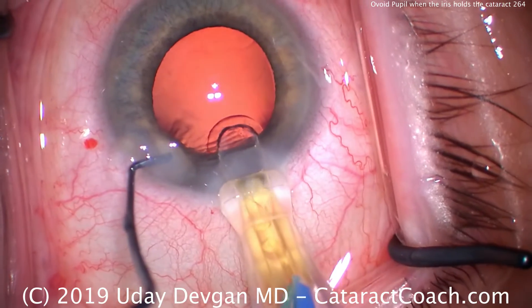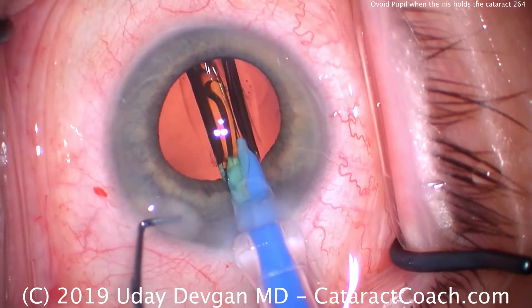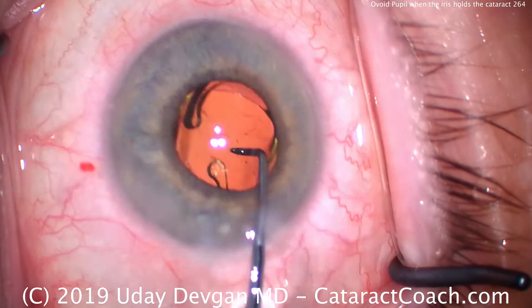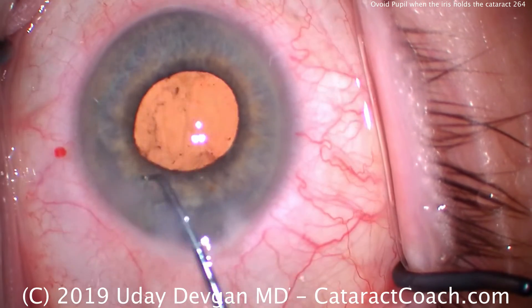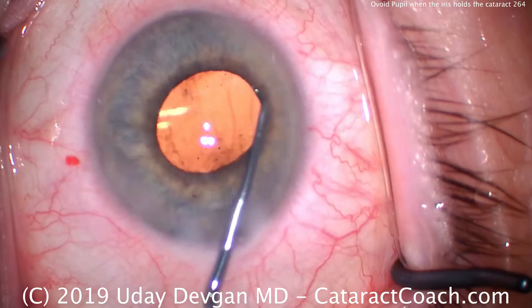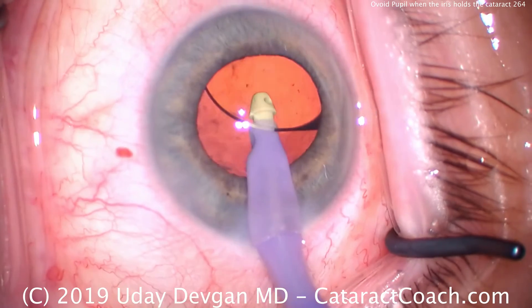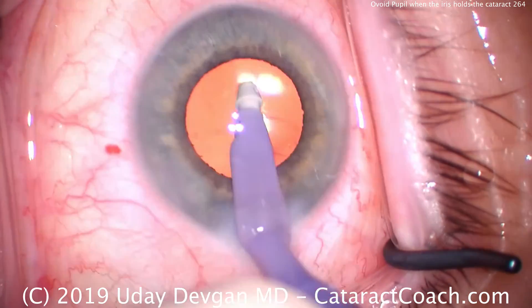Here is the end of the case. The pupil looks a little larger here because there's viscoelastic in the eye — as soon as you take the viscoelastic out the pupil will come back down to smaller size. Advancing the lens is a lot easier to see compared to the brown eye shown earlier. Let's make sure everything goes in the capsular bag. We can check in all meridians — looks clean, nothing there, looks great. Take the IA probe, go underneath the lens, remove the viscoelastic, and finish the case. These patients obviously don't have ovoid pupils to begin with — they get that way when we use the trick of having the pupil hold the nucleus.